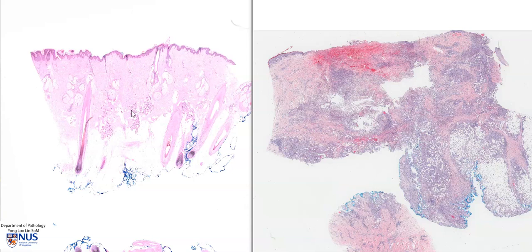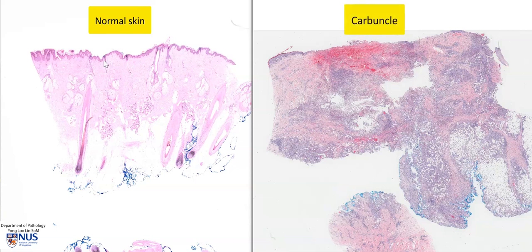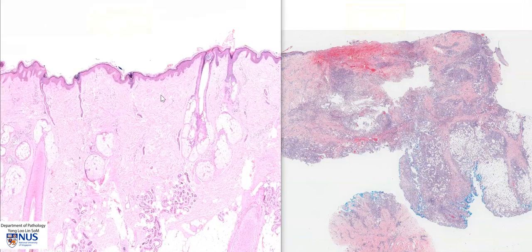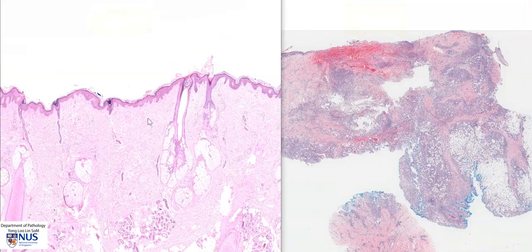Hello, we are looking at two virtual microscopy slides side by side. On the left, we have normal hair-bearing skin, and on the right, we have a carbuncle. First, I'm going to demonstrate some of the features of normal skin, and let's take a look at the layers.